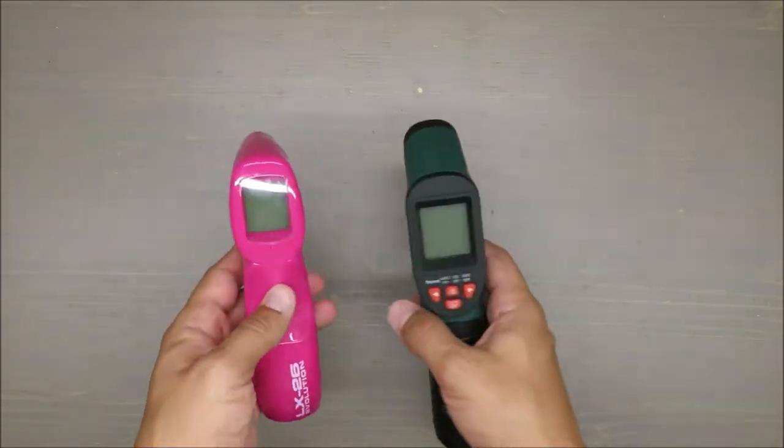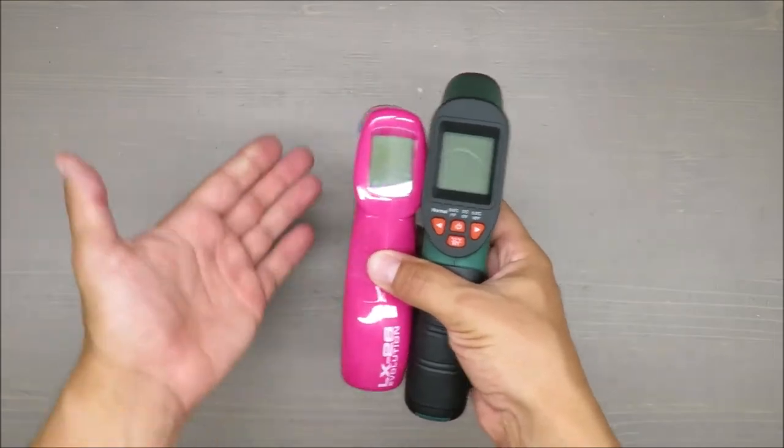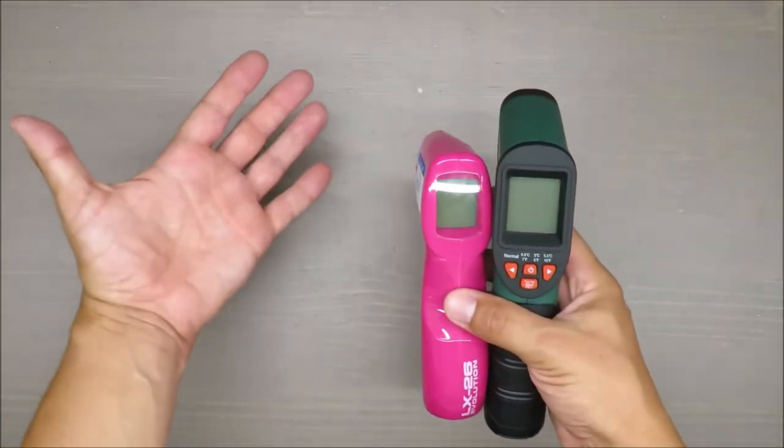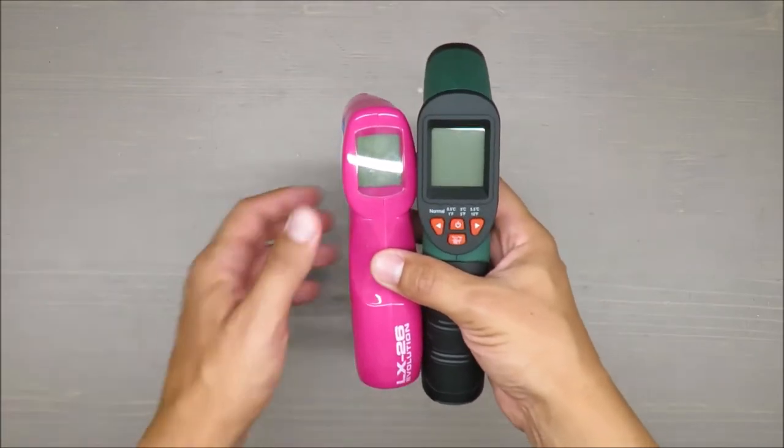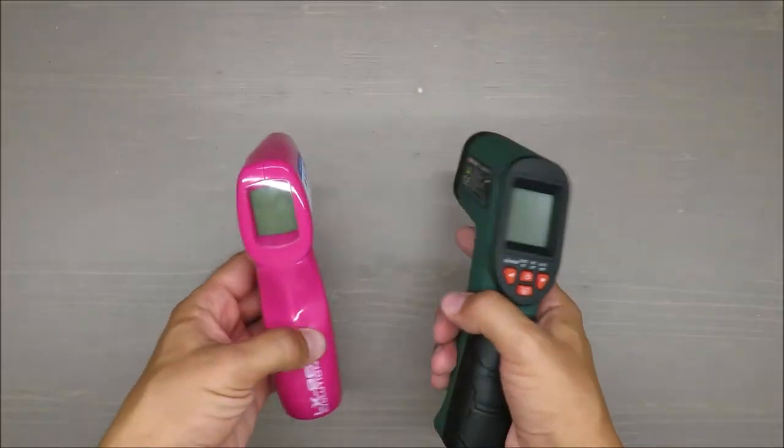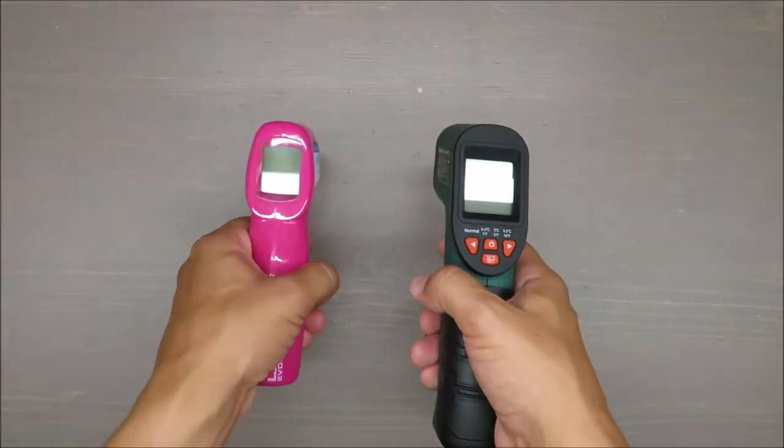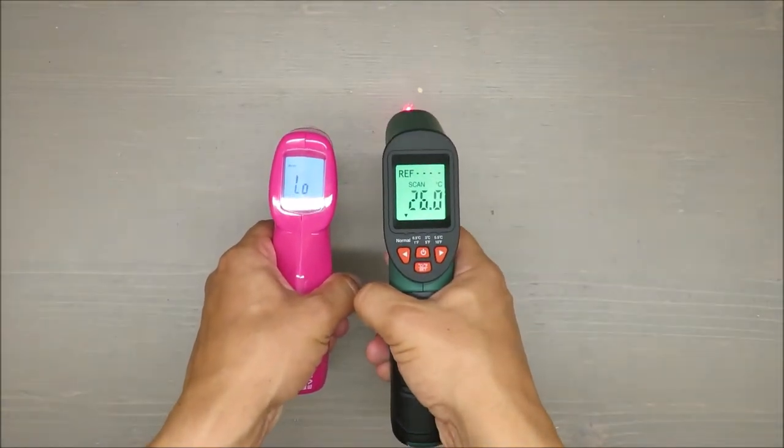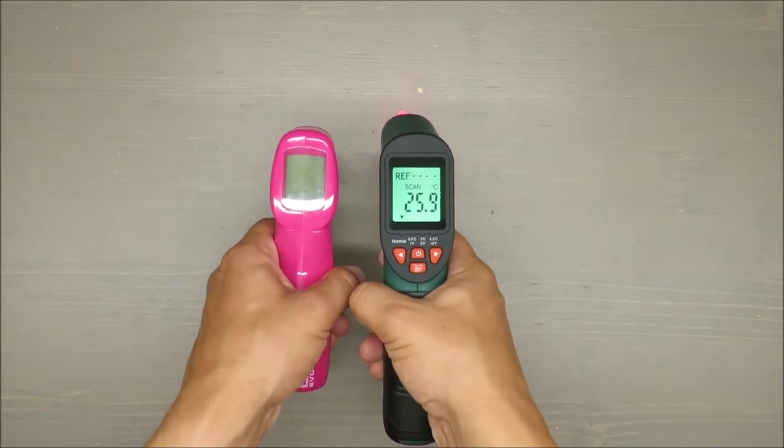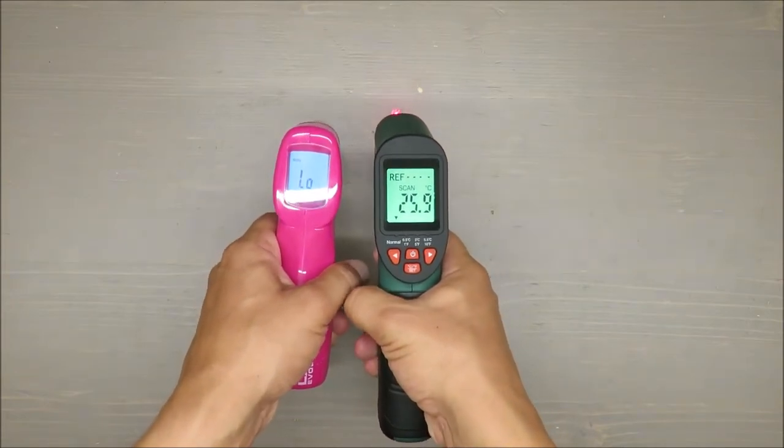Let's start from the desk. Too low, 26. So actually we can see it's not even detecting the temperature. Let's move to my hand. 36.7, 33.7.